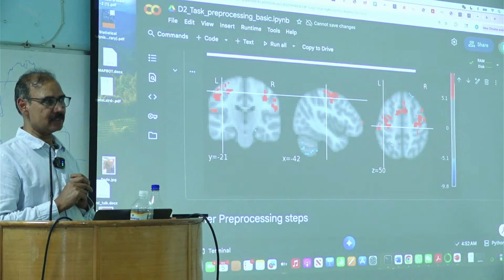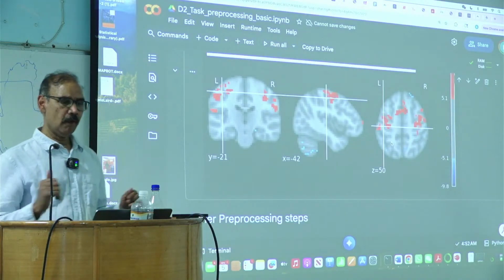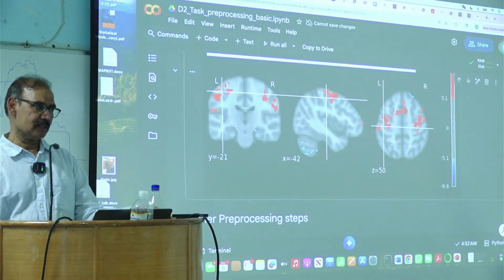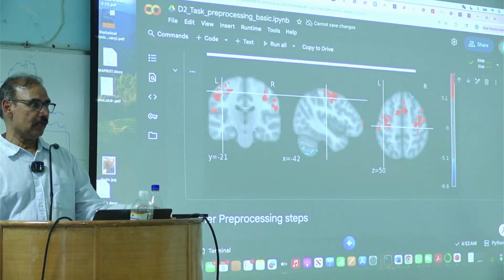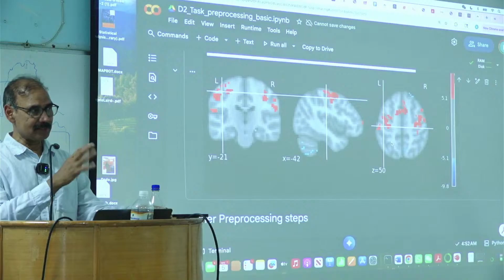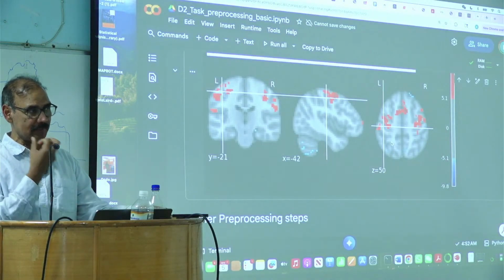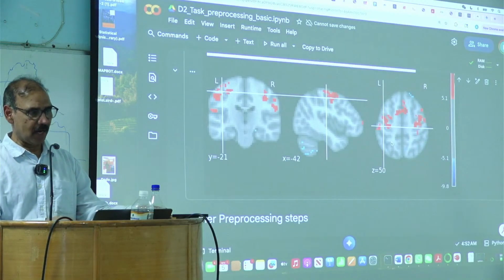How many places can do PET and MRI? Then if you use EEG, it has its own headaches. If you do fNIRS, it's mostly superficial. So that is where fMRI is useful because it has decent spatial and temporal resolution and doesn't have any harmful effect.